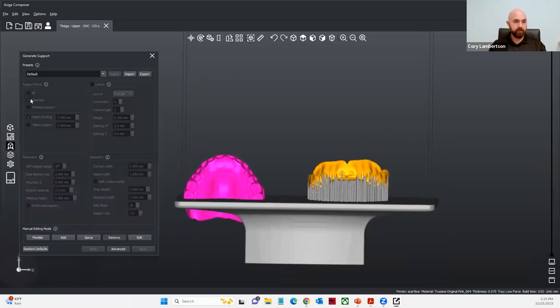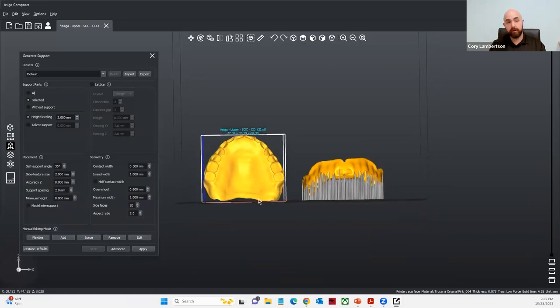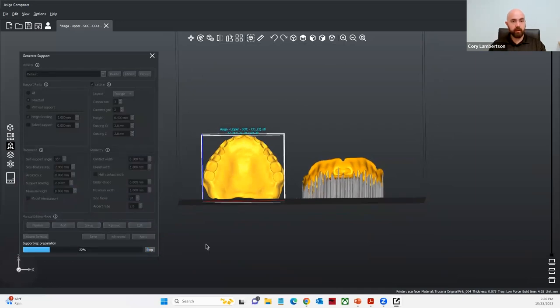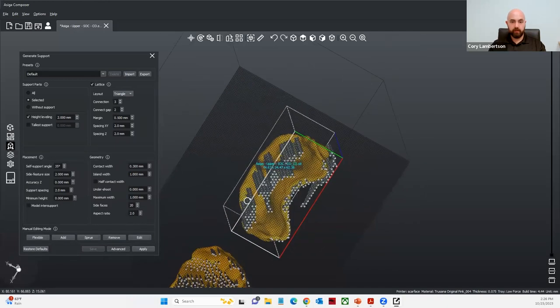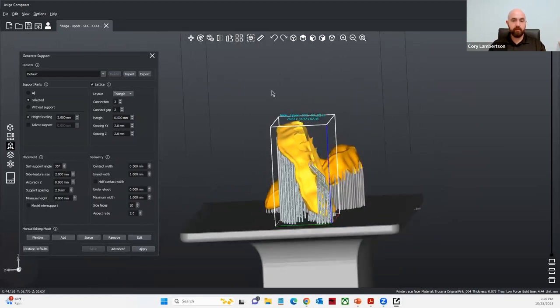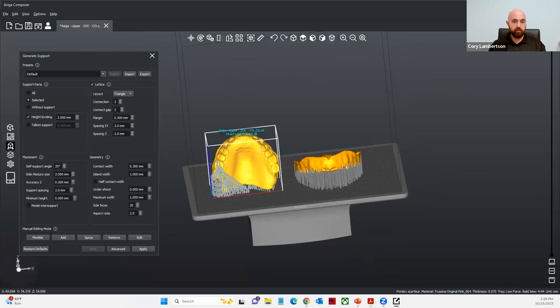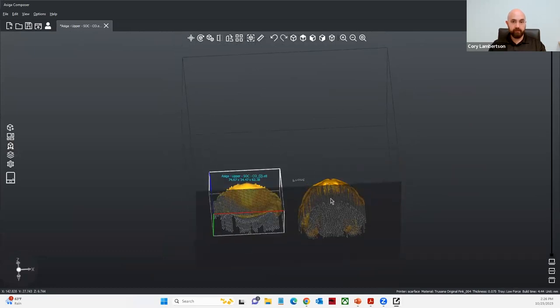Let's jump over to this other denture. I was speaking with one of our contacts at our office in Germany, and he did some tests printing with lattice-style supports with this material — it actually works really well. I'm going to go ahead and simply hit Apply, and now we can see the actual support structures. That lattice support turns out really well. This is something the teams are looking at to see if it can be added to the instructions for use. I personally prefer printing at a more vertical inclination versus the 20-degree angle.